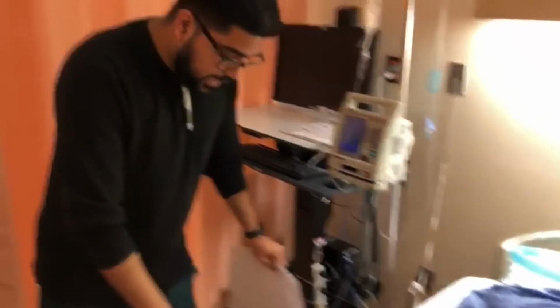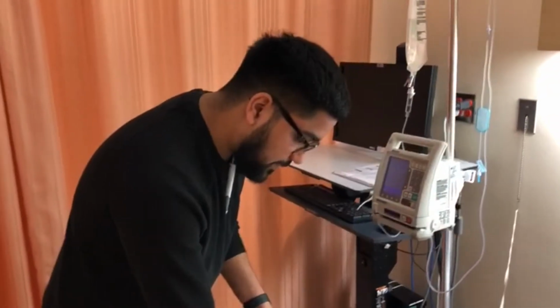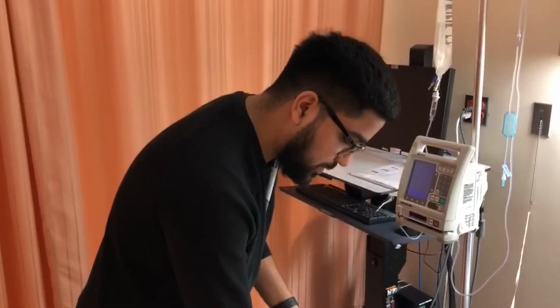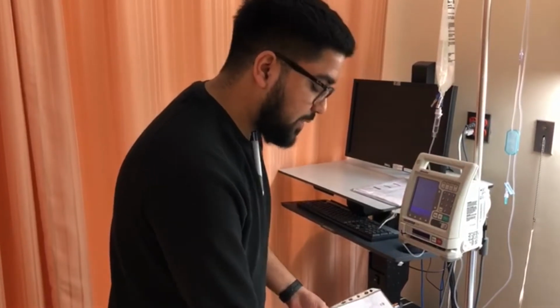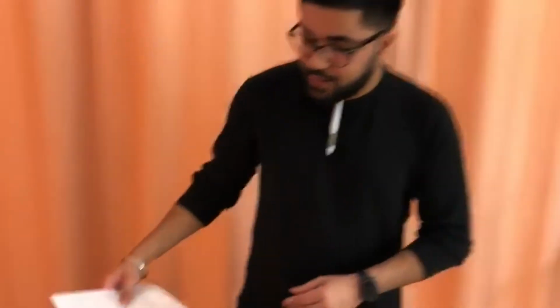trach dressing change. As I come in, I'm going to make sure everything's okay, make sure the IV pump rate is good, make sure everything for the trach is also good, which you can verify after. I can verify the name. So we have Fred Fredrickson, MRN number is 0990127, 37 years old. I can ask him to speak and ask for his name. Fred Fredrickson. Okay, good. So we are verified that we have the correct patient here.